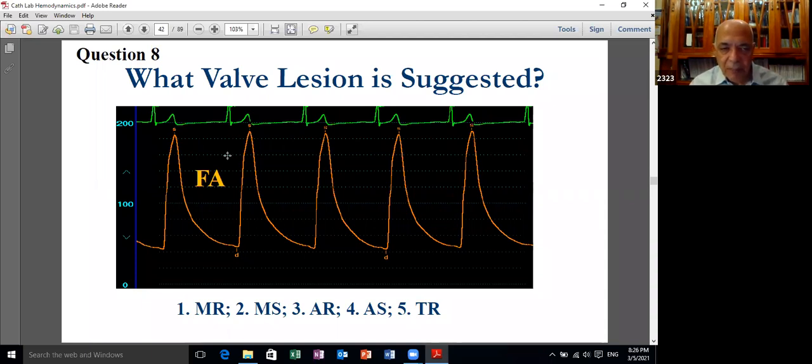If you find this picture, then you realize that the arteriovenous fistula is overburdening the heart to some degree. As you see, because of the peripheral vasodilatation in these patients, the dicrotic notch is down here. Sometimes it's down here because this is an elderly individual and you don't get a recoil from the aorta. So looking at the pulse pressure, you can get much more information than just calculating the pulse pressure.